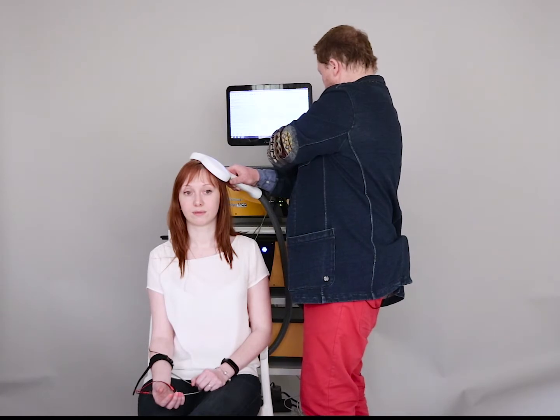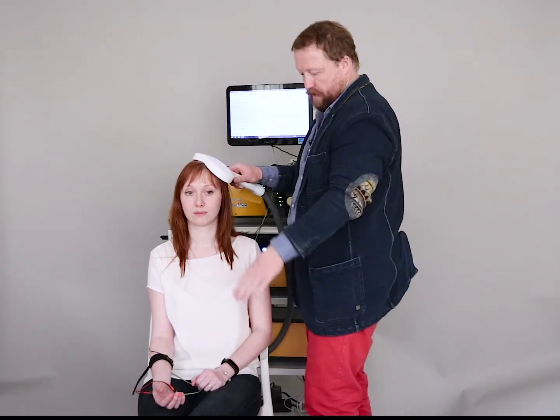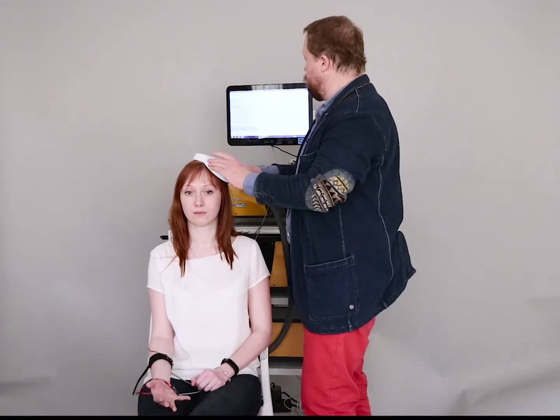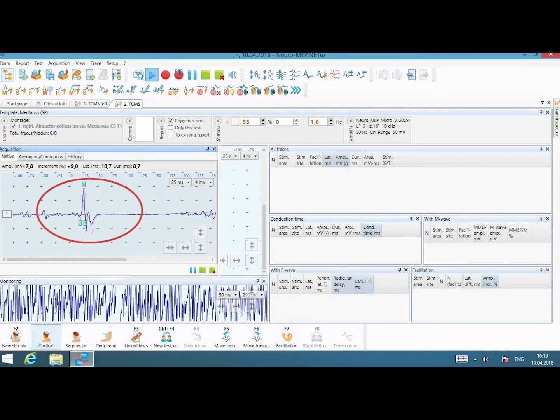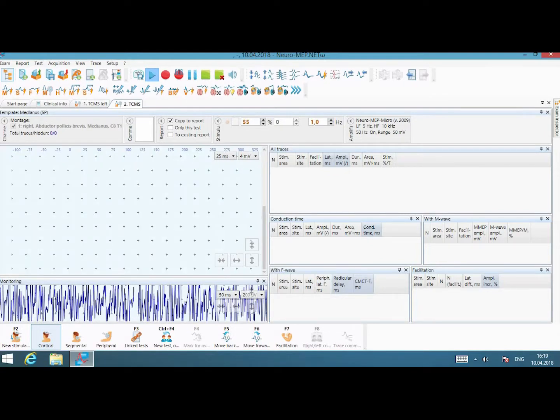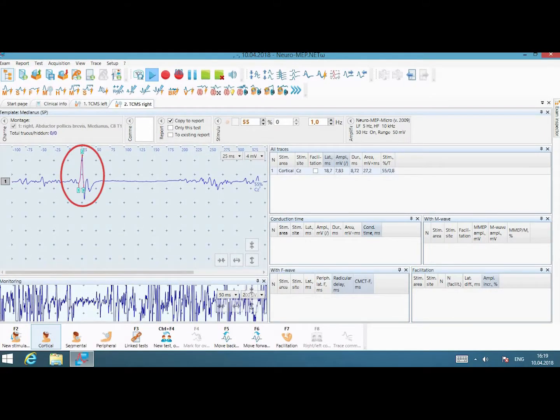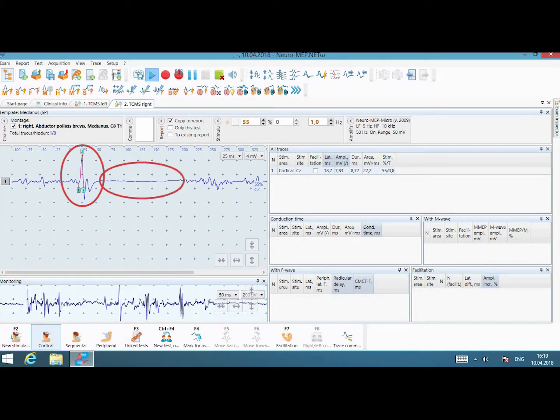And now please contract the muscle and I will deliver the stimulus during voluntary contraction. Okay. And save it. Thank you.